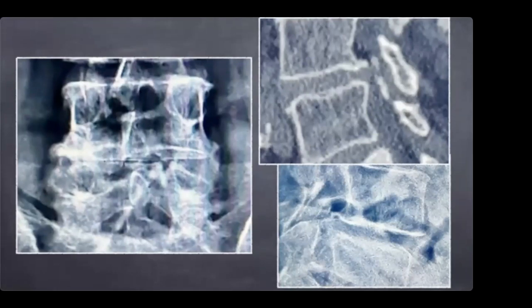The CT scan also confirms the calcification in the flavum. You can see the arrow over here. And you can see the marginal listhesis over here and a claw formation behind over here in the X-ray.